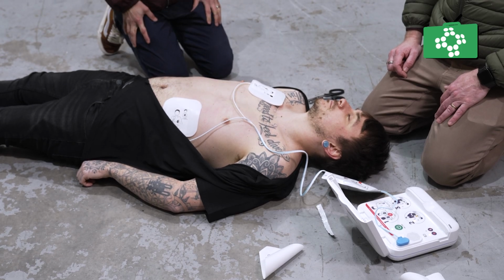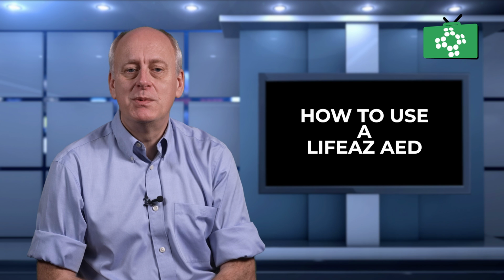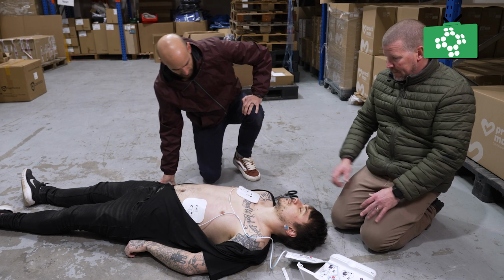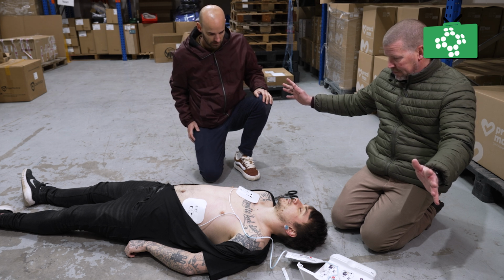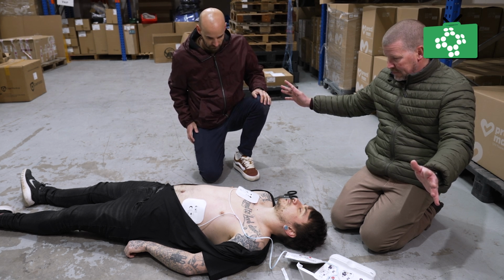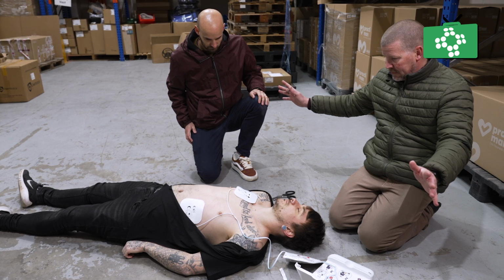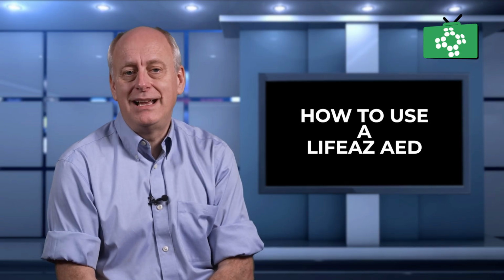Once the pads are in place, the AED unit will start analysing the heart rhythm automatically. You must follow the voice prompts when it says do not touch the patient to avoid anyone else getting a shock or the AED detecting another heartbeat. Ensure no one is touching the victim. Loudly state something like, "Everyone stand clear." The unit will tell you it's assessing the heart rhythm, do not touch the patient. A fully automatic AED does not require you to push a shock button.